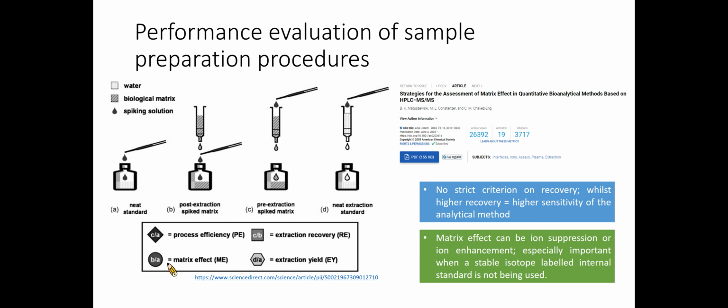Interference may also affect the sample preparation, leading mostly to a decrease in the extraction yield when compared to standards. The recovery of extraction in the presence of the matrix, or extraction recovery, should therefore be determined with the ratio of pre-spike over post-spike peak areas. However, this calculation does not allow for differentiating a low extraction recovery due to interfering compounds from a poor extraction yield due to the sample preparation itself.